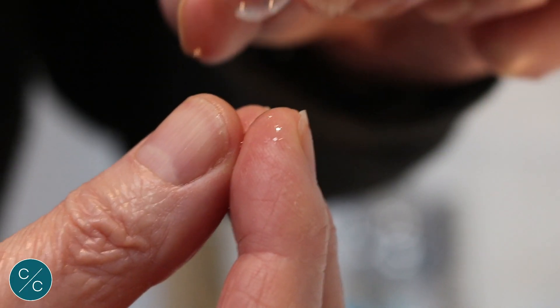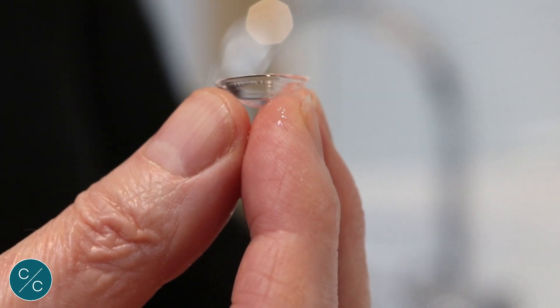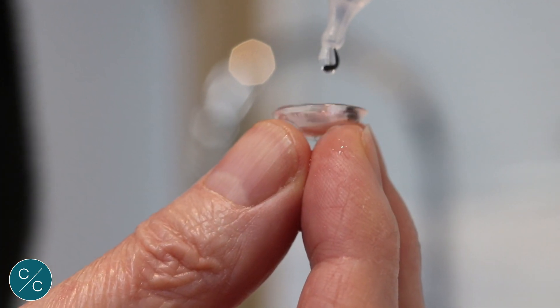Okay Sue, so when we've washed our hands, what we're going to do is place the lens onto the tip of these three fingers that make a tripod. We're then going to fill the lens bowl up with fresh saline to the point where you've actually got a meniscus over the top — almost overfilling.